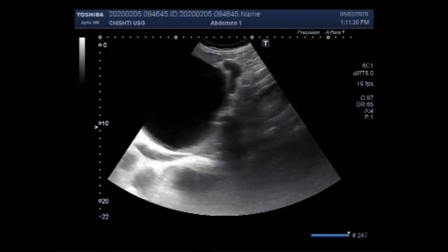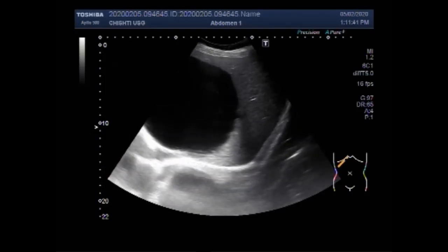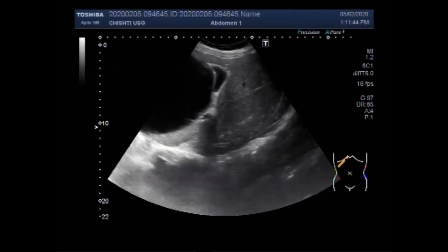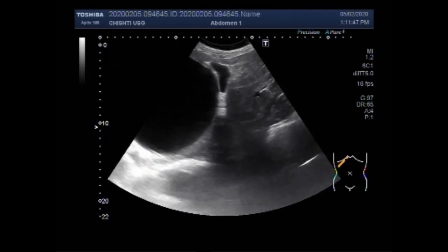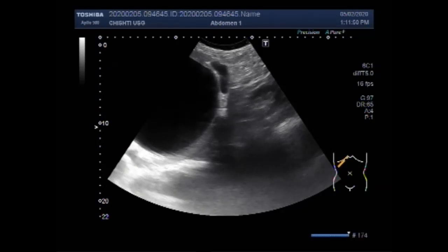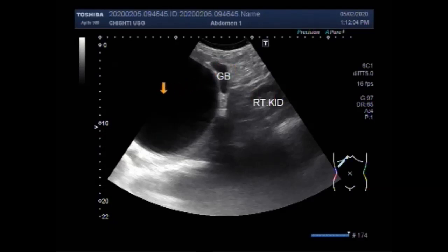This ultrasound video shows two cases: one of hepatic cysts and the other of a hepatic mass. You can see a large hepatic cyst. In general, hepatic cysts are thin-walled structures that contain fluid. Most cysts are single, but sometimes there may be several. Symptoms associated with liver cysts include upper abdominal fullness, discomfort, or pain.